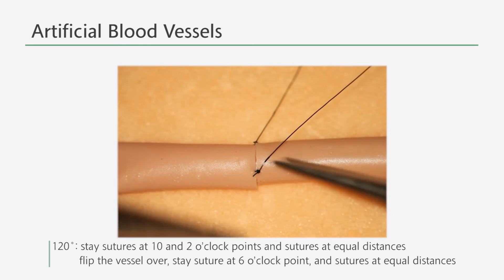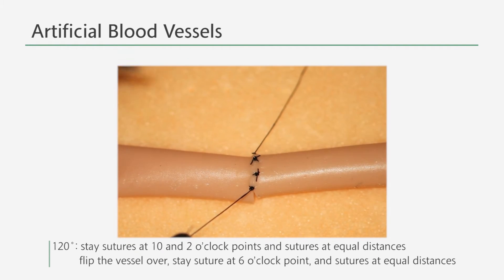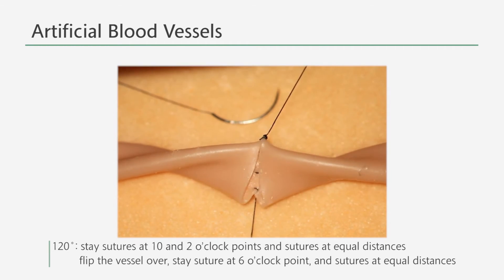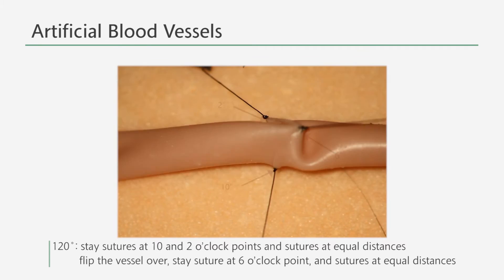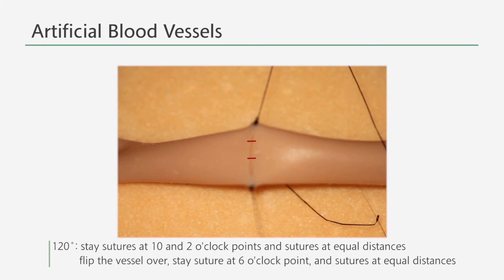For the ninth stitch suture, perform the stay sutures at the 10 o'clock and at the 2 o'clock point and divide the sector into three equal parts to perform two more sutures. Then turn the vessel around to suture at the 6 o'clock point and repeat the same procedure for the rest of the two sectors.